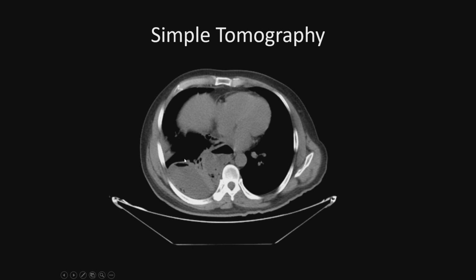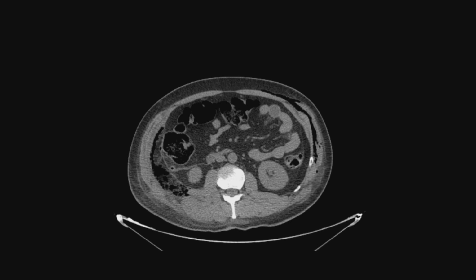So it came to our attention that when the patient was taken to the CT, the abdomen was superficially distended, and when you touched it, there was some crackling. Because of the crackling, we told the technician to do an abdominal CT as well at the same time. And this was the interesting thing. We look at that, and there's a lot of gas in the walls of the abdomen, a subcutaneous emphysema in the abdominal wall. Imagine if we tried to do an ultrasound with this amount of gas.